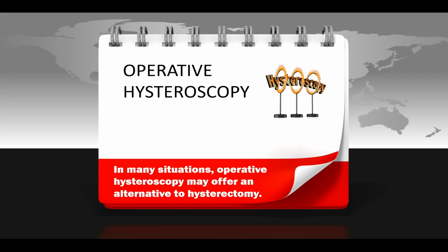So we will see a little bit about the operative hysteroscopy. In many situations, operative hysteroscopy may be one alternative to hysterectomy. Because if you are not doing operative hysteroscopy, then in many of the pathologies, the only option you have is hysterectomy. But if you are very good in operative hysteroscopy, many causes of hysterectomy can be minimized, and just by operative hysteroscopy the patient can be cured.